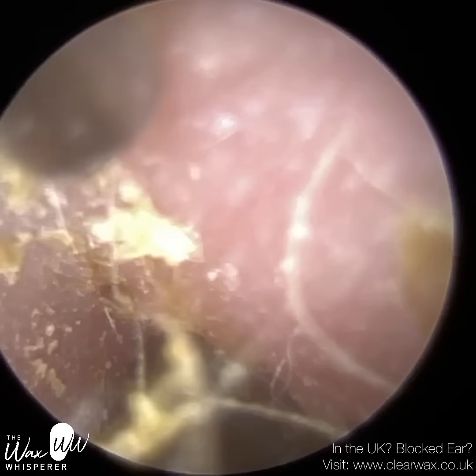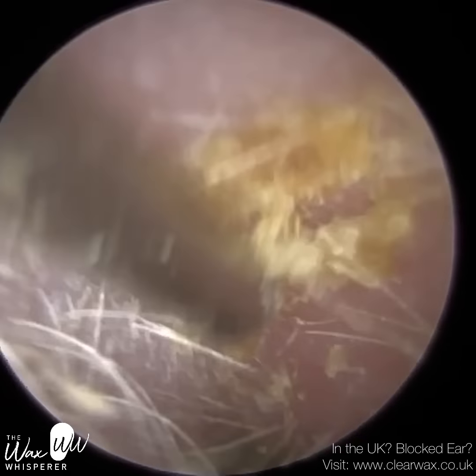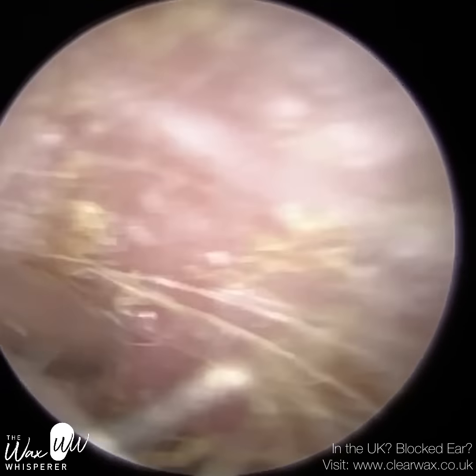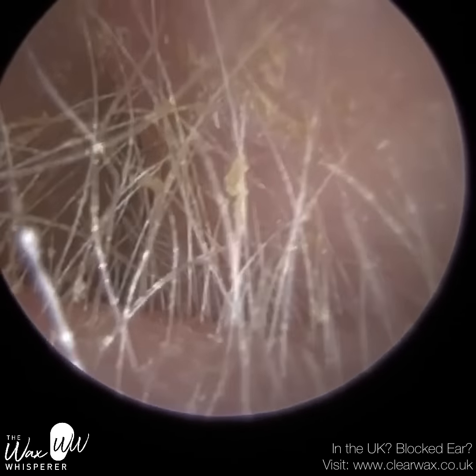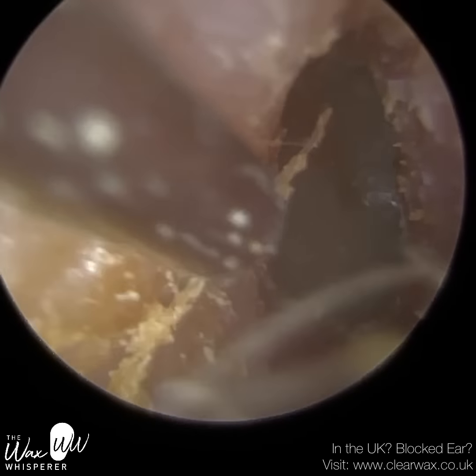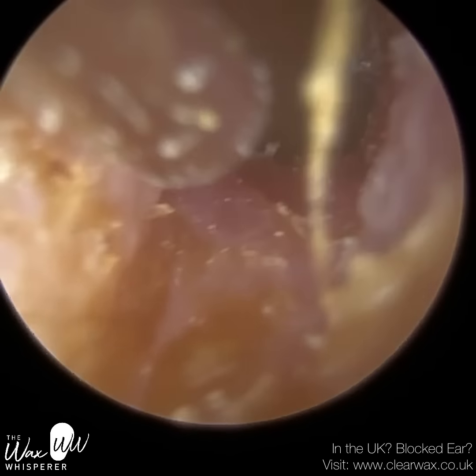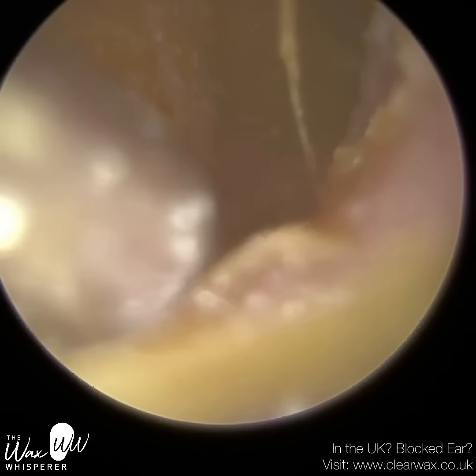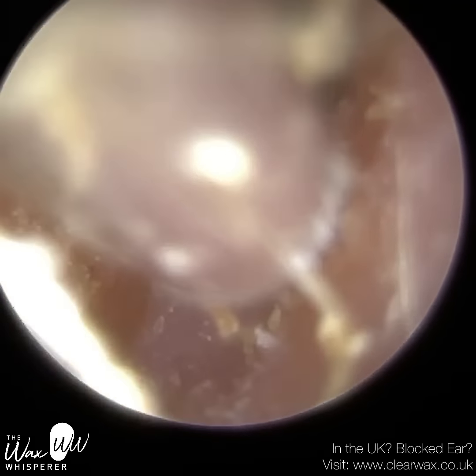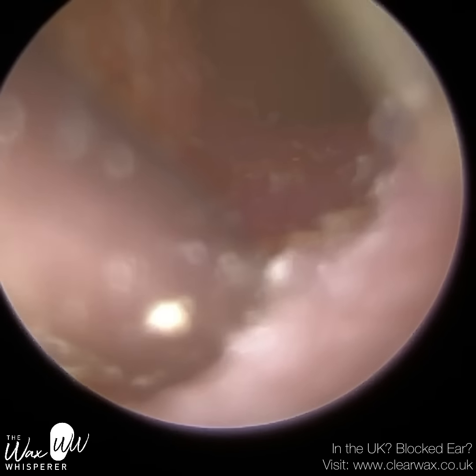So this is the cartilaginous portion here. We can put a bit more pressure on there because it's not going to be uncomfortable for the patient. Even with the ear being tender and swollen, they're tolerating the procedure very well indeed. At this moment, right near the entrance, and this is on the back part of the ear canal, you can see the eardrum to the right. See how much cleaner the ear is. Just at the base of the ear canal is another layer of skin. We're just trying to peel this away. So we've given this ear the best opportunity, I feel now, for the antibiotic spray to work its magic.